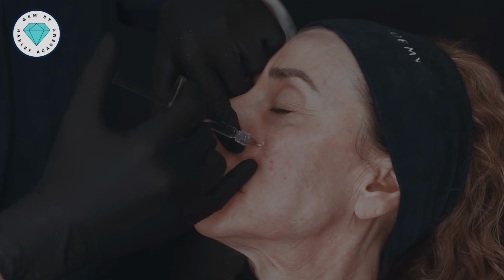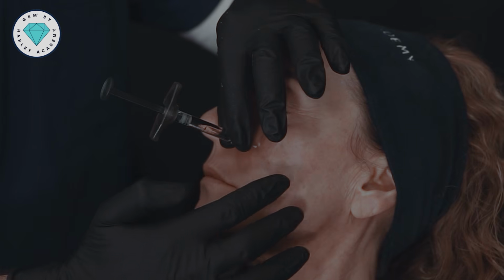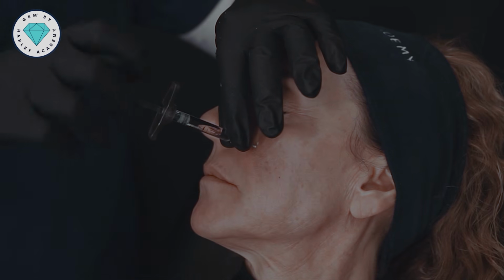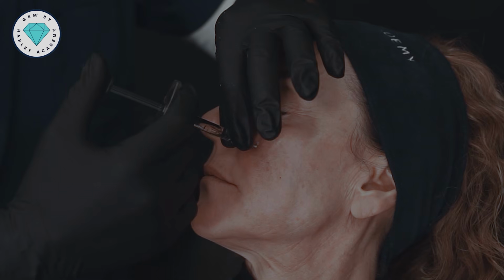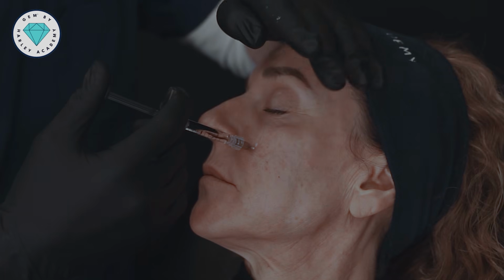Perfect. And we go deep. We touch down onto the maxilla. And this is where aspiration is going to be really important. Okay, so I'm happy that I'm not really tethering down any of the tissues. And I'm going to do a good 10 seconds aspiration. Okay. Happy there's no blood in the hub of the needle. And really important here that we have slow injection pressure.